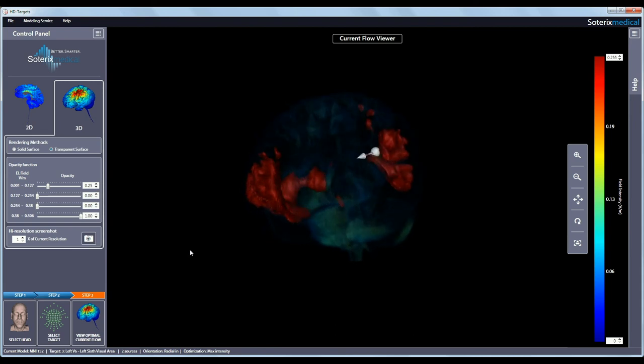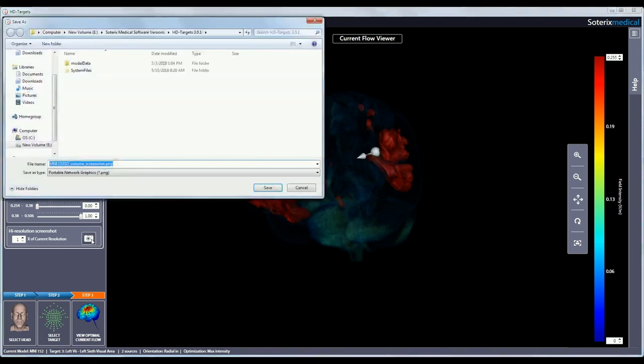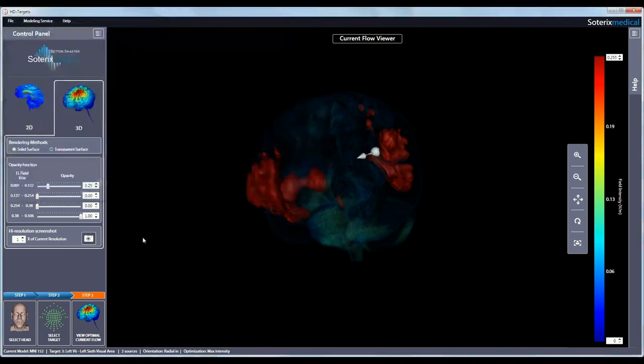If at any point you want to save what you are viewing, click on the camera icon and save your image. If you want a higher resolution image, you can increase the resolution to up to 6 before saving the image.